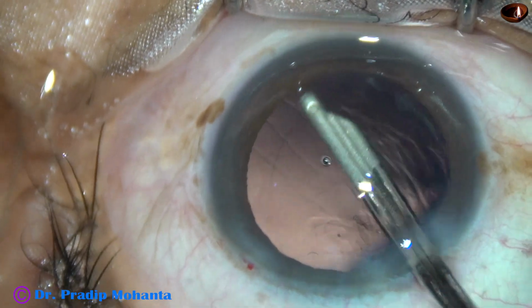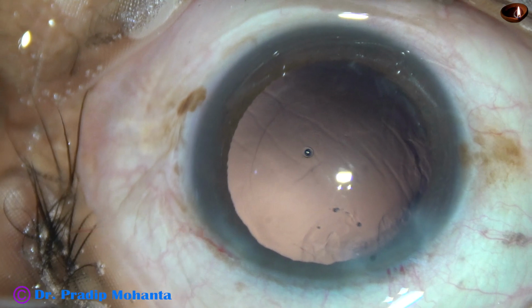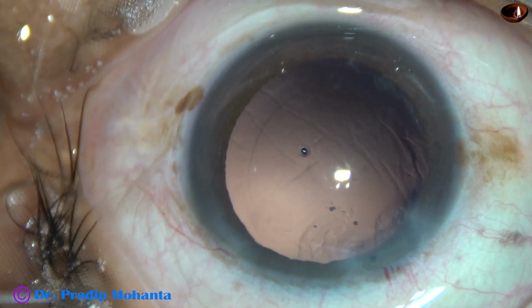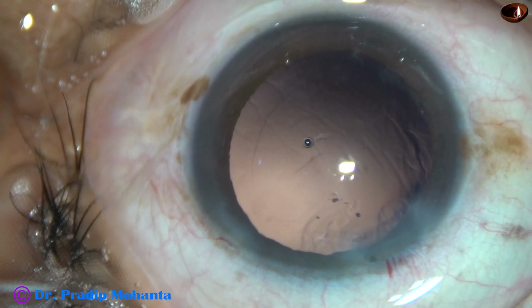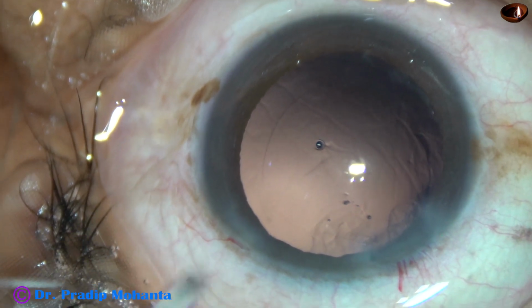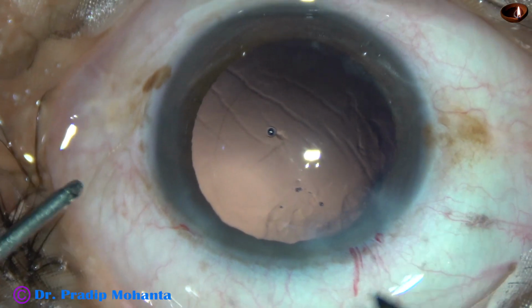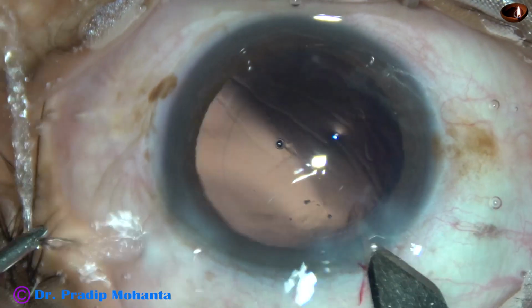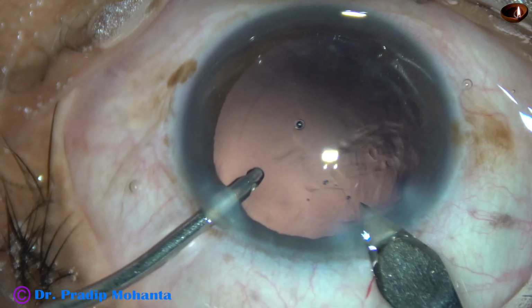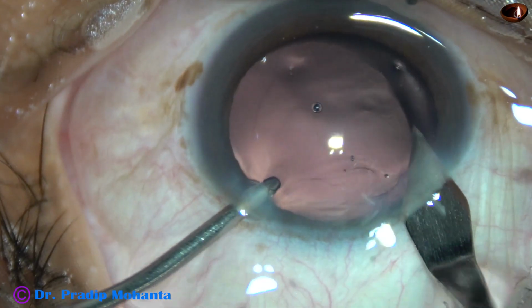So we must be very careful in removing the cortex if we are using the handpiece itself. If we are using the phaco needle itself to remove the cortex, we must use very low vacuum and we must have patience to very slowly aspirate the cortical lens matter.